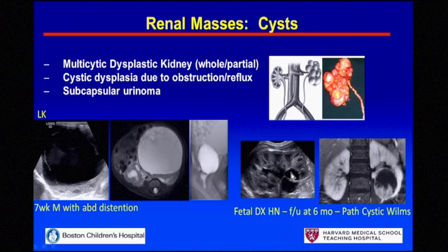They had an ultrasound soon after delivery, and there was a septated cyst observed in the lower pole of the kidney, not hydronephrosis. This was thought to be a little bit unusual and was followed over time at about 6 months with another ultrasound, and at this point it seemed as though there was a solid component. We went on to additional cross-sectional imaging and saw this flame-like enhancing soft tissue, and sure enough, this proved to be a cystic Wilms tumor, so indeed a neoplasm. So be cautious, not every cyst is a neoplasm, but not every cyst is a simple cyst.